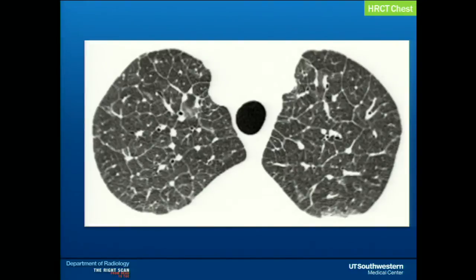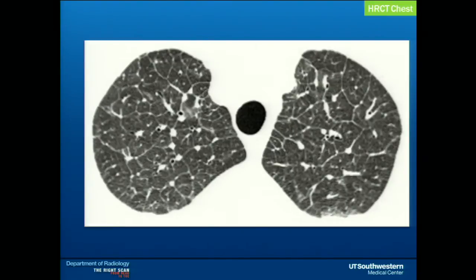This particular image is a high-resolution image of the lungs which nicely shows thickened interlobular septa outlining the secondary pulmonary lobule. This patient has interstitial pulmonary edema. You can nicely see that the central lobular artery, which is in the center of the secondary pulmonary lobule, is 0.5 to 1 millimeter in size, and you can see those vessels on the CT scan.